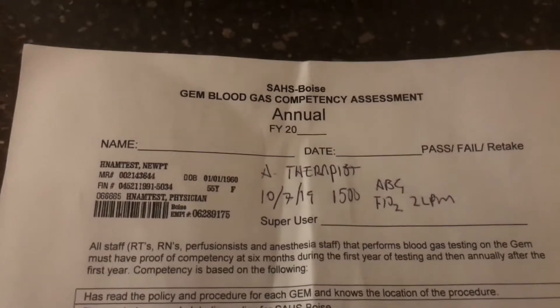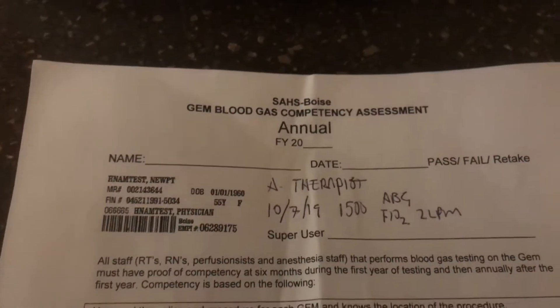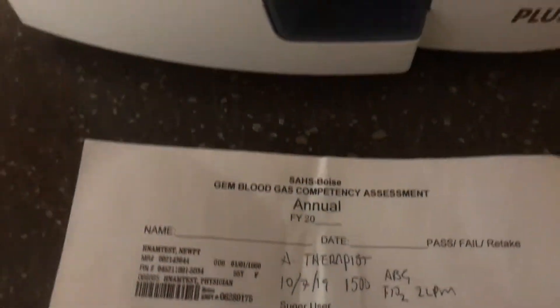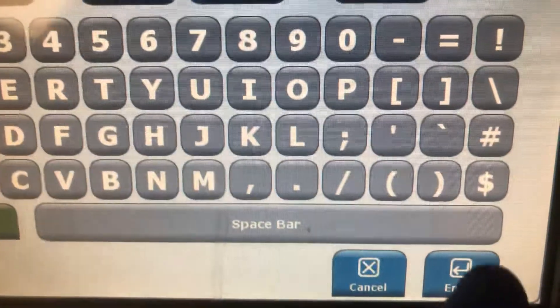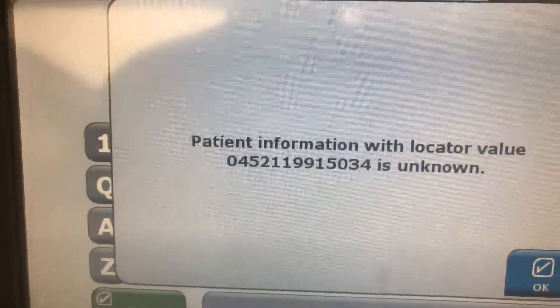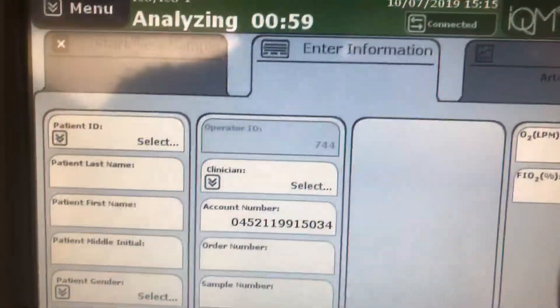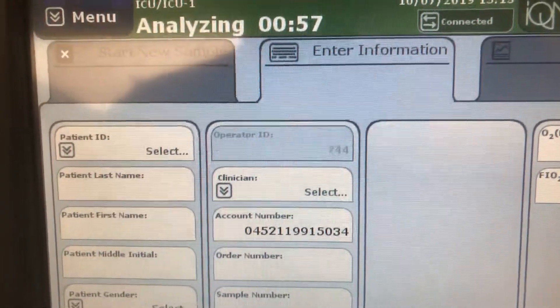We are with a test patient. Notice that you have the correct identifiers here: name, date, time, and sample type. We're going to scan it — it puts in the account number up here. We press enter and it says it's unknown because it's a sample patient, but your patient's information would come up at that point.